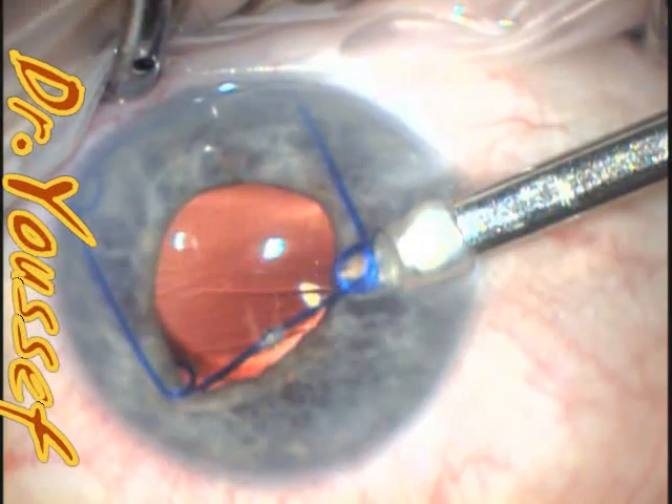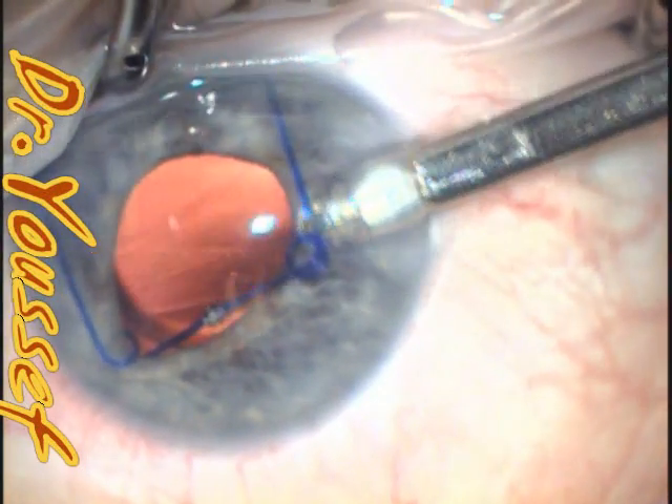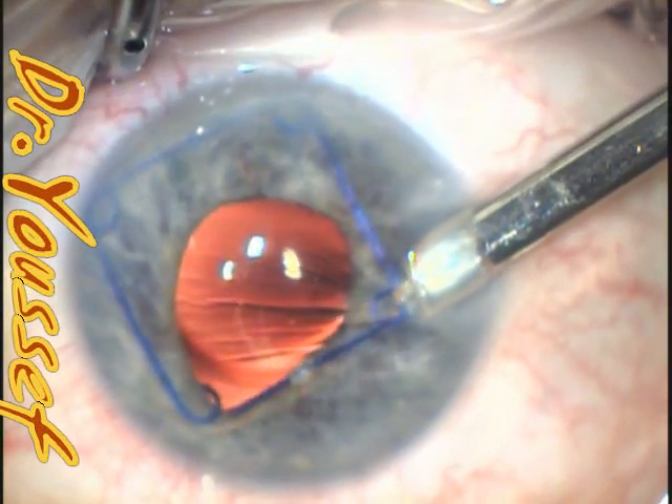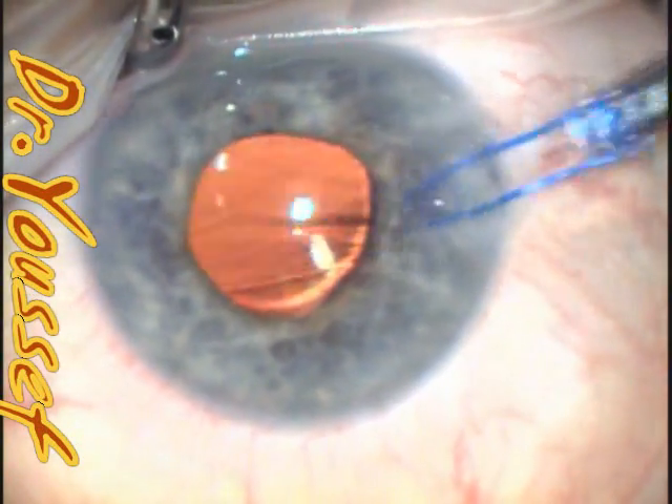The trick here is that you have to engage both parts of the ring — the anterior and the posterior part — otherwise it's going to hook the wound on the way out. As you can see here, it's engaged correctly and everything is coming out nice and easy.